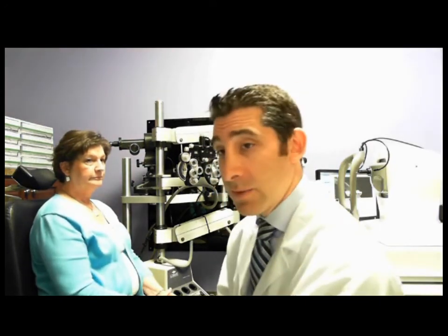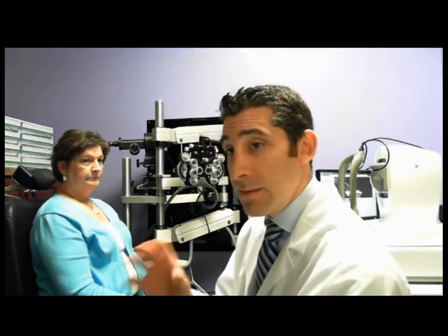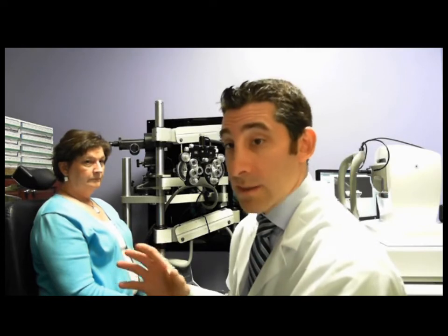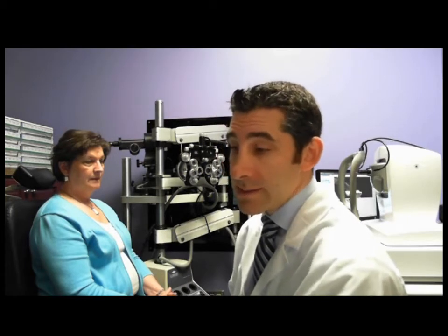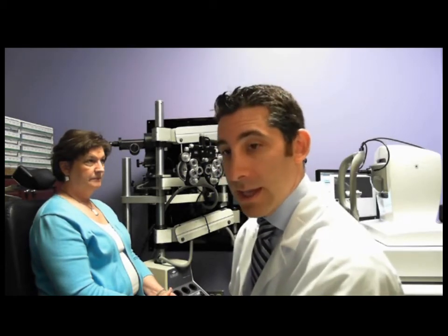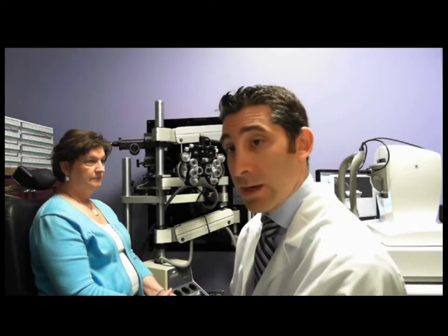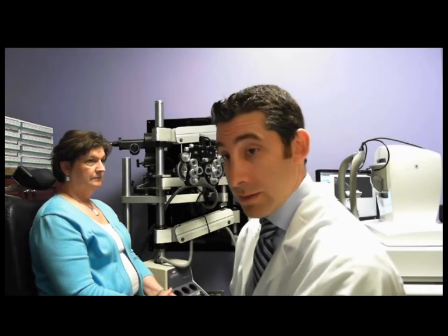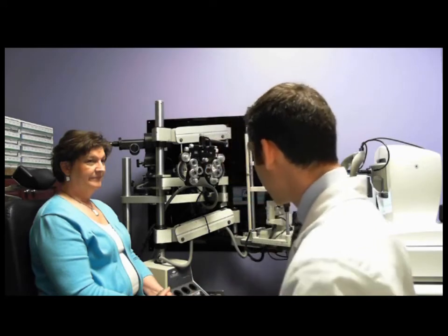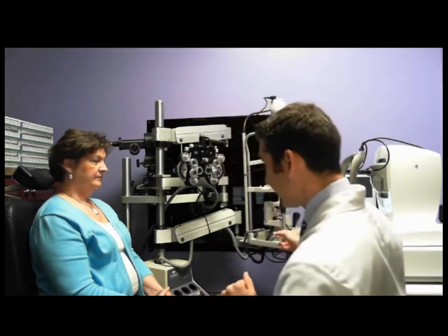All right, so what that tells me right off the bat is that this lens is impacting the cornea somewhere. So it's hitting the cornea. So in my mind, I know that I'm going to be looking for that. It doesn't tell us more sensitive information than that, but it tells me that somewhere this lens is impinging either the sclera or the cornea. All right, so next, let's take a look using the slit beam.